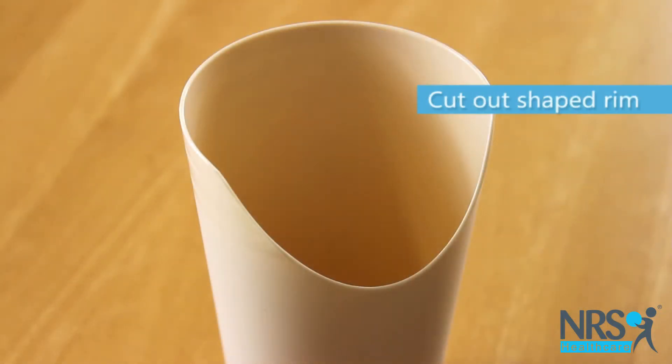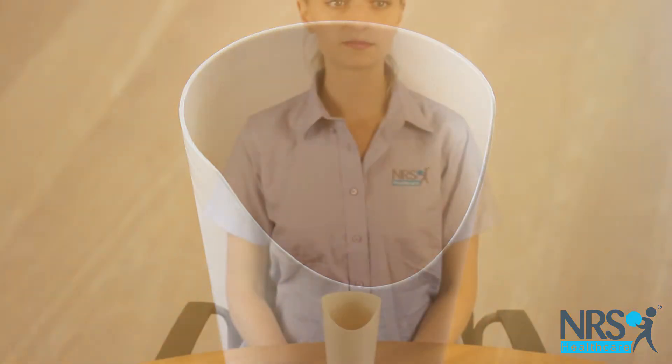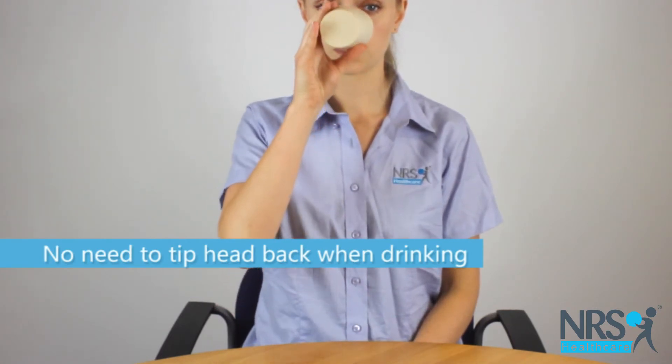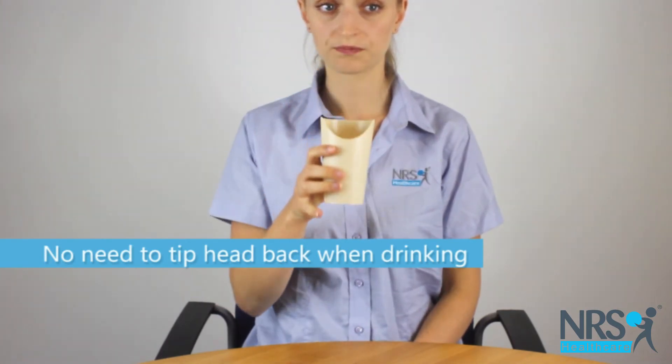It has a cut-out shaped rim on one side which gives space for your nose when you tip the cup to your lips. This means you can drink whilst keeping your head and neck fairly still if required, and there's no need to tip your head back when drinking.